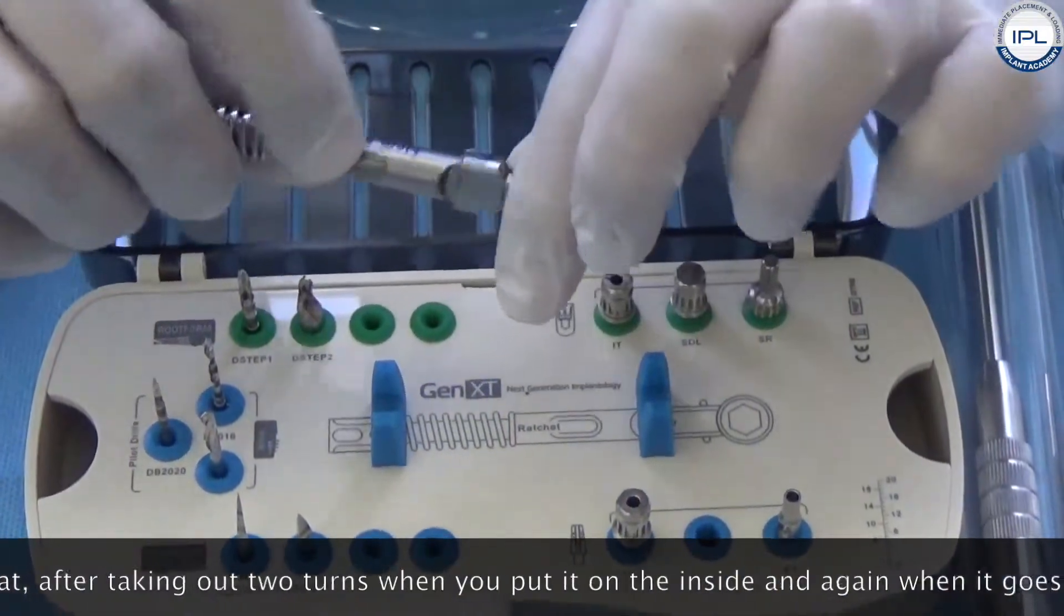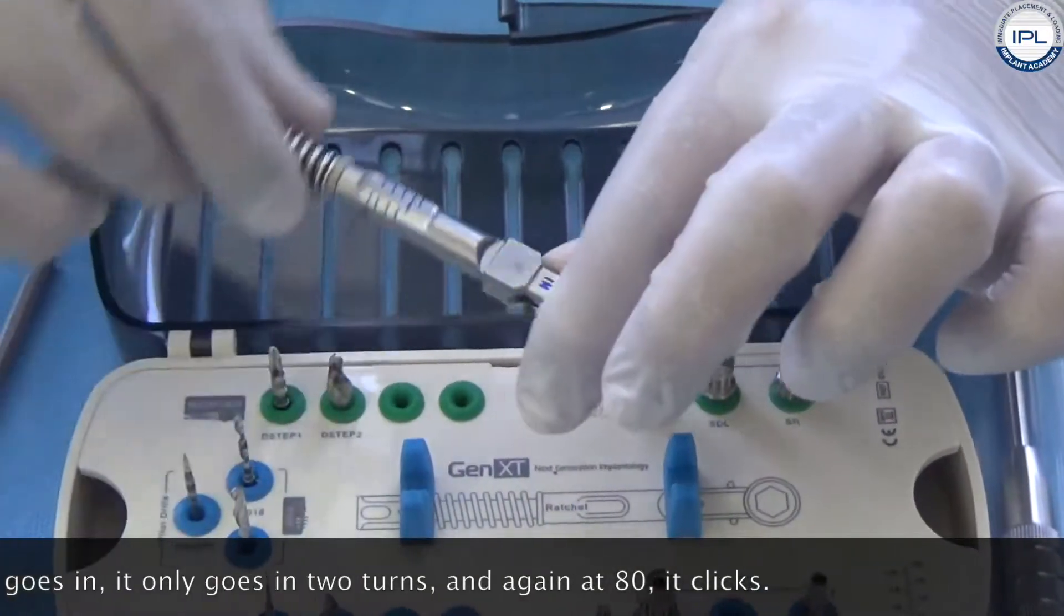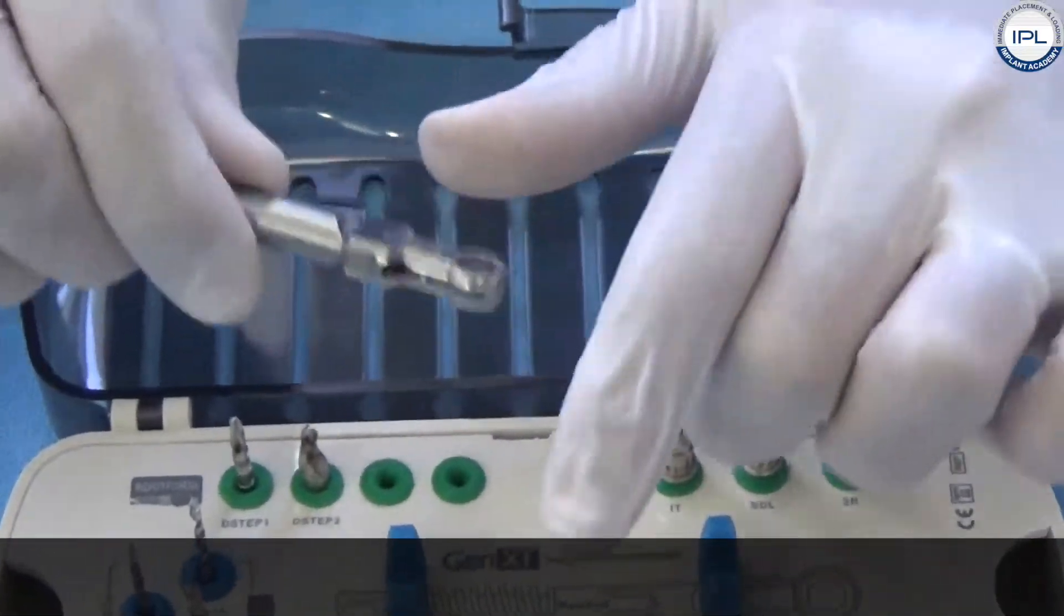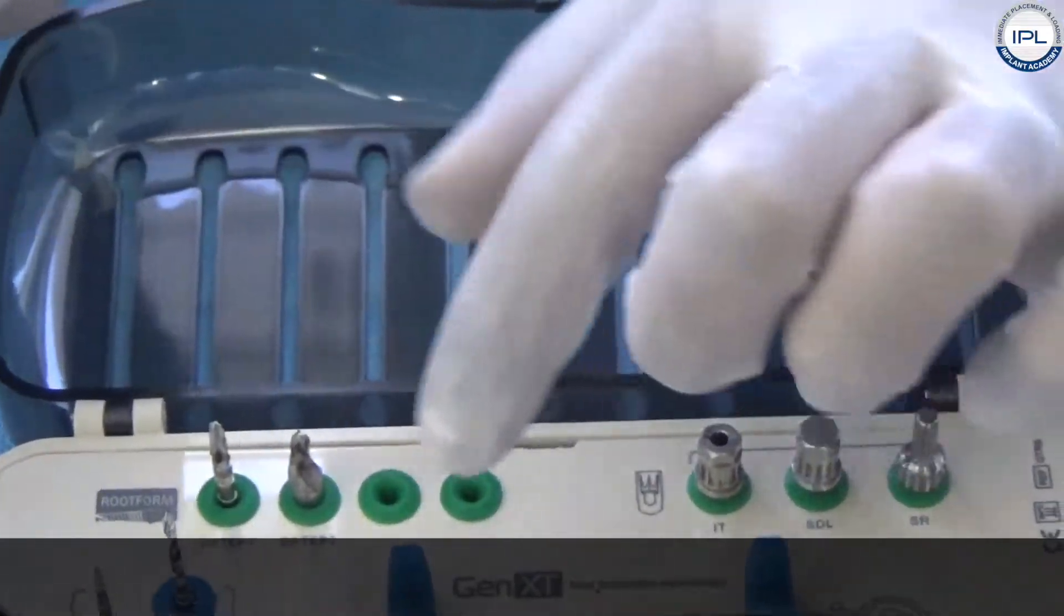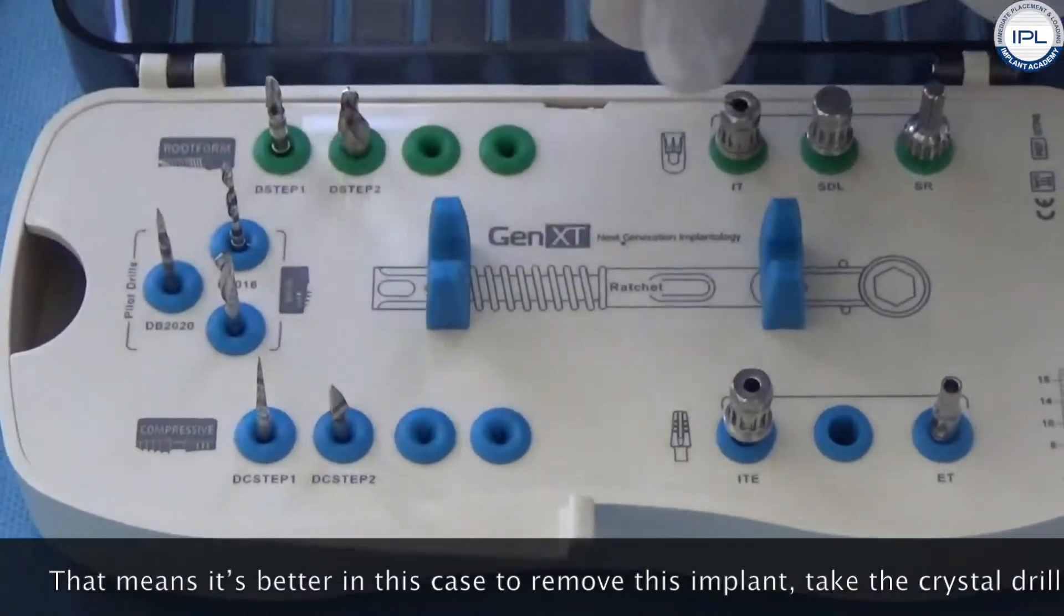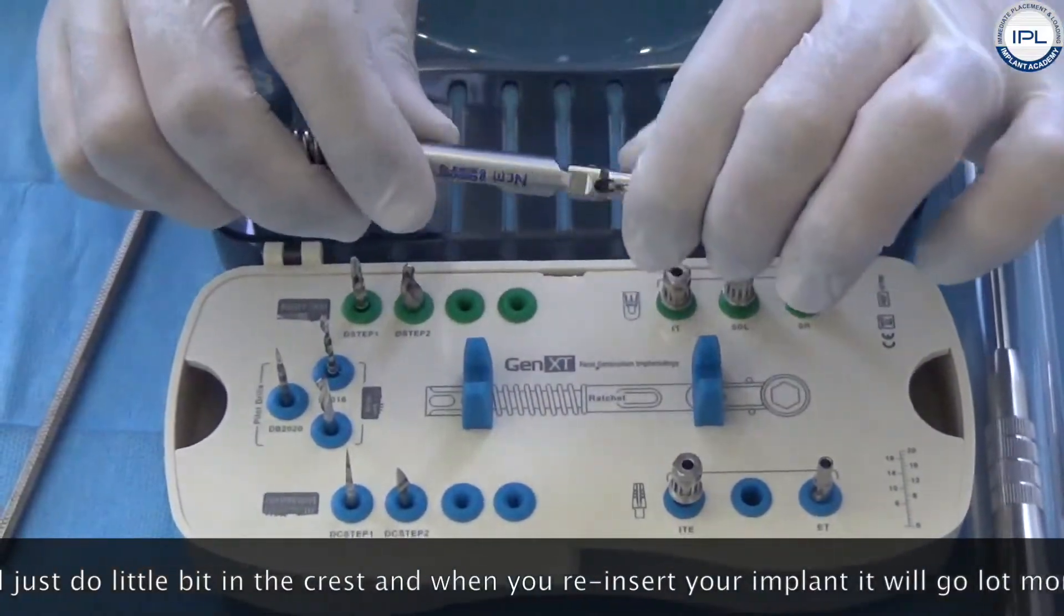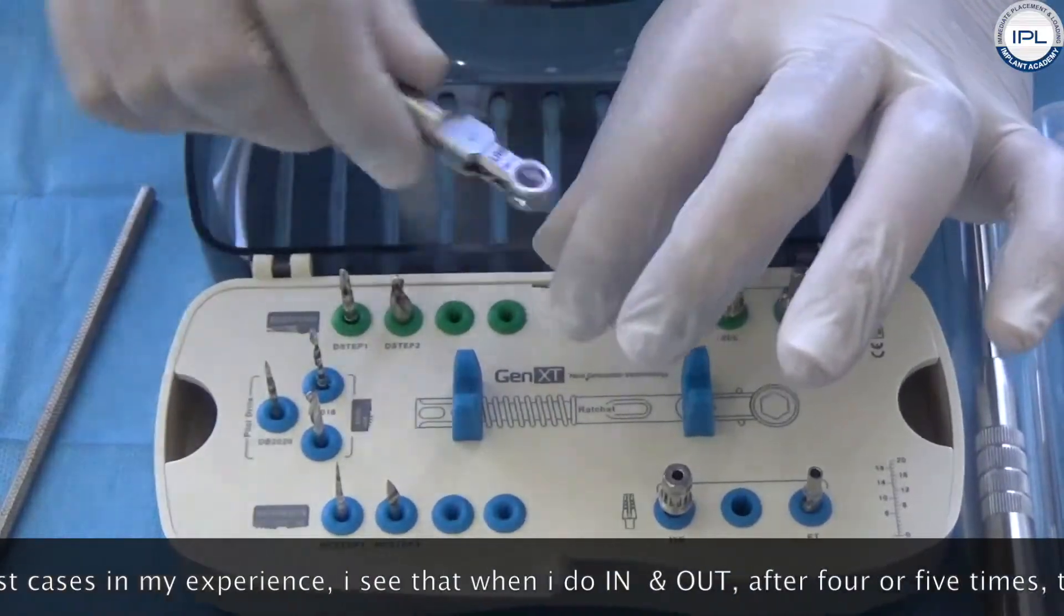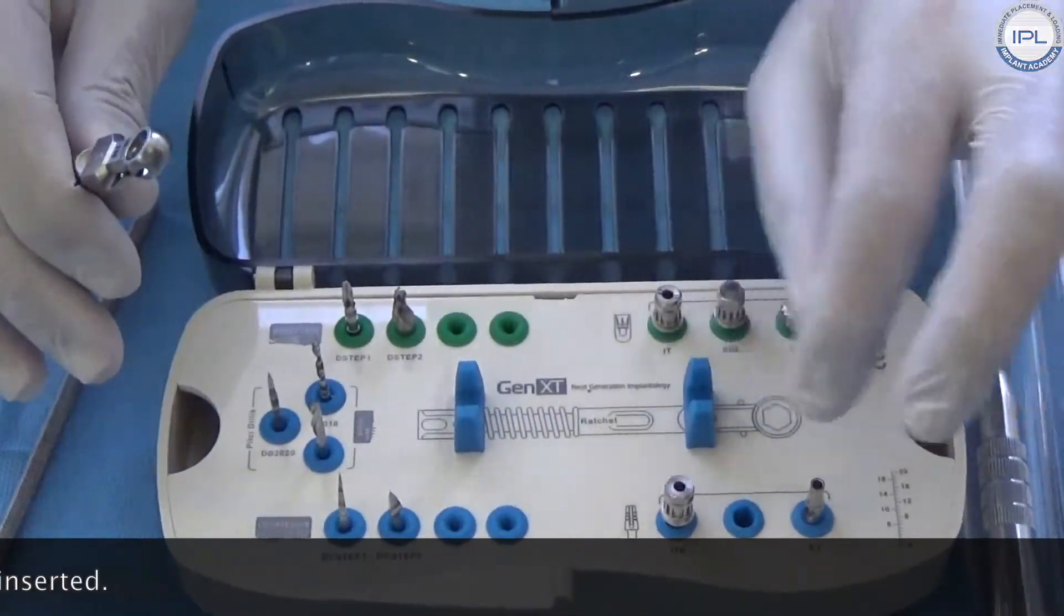Should you have a situation where after taking out two turns, when you put it on the inside and again when it goes in, it only goes in two turns and again at 80 it clicks, that means it's better in this case to remove this implant, take the crestal drill if it's the compression implant, and just do a little bit in the crest. When you reinsert your implant it will go a lot more easier. But in most cases in my experience, I always see that when I do in and out, in and out, after four or five times the entire implant is inserted.